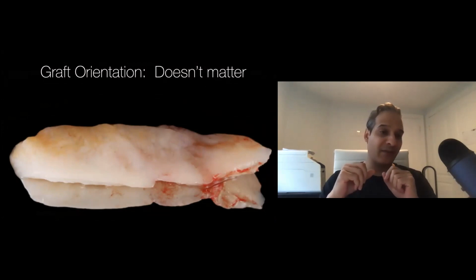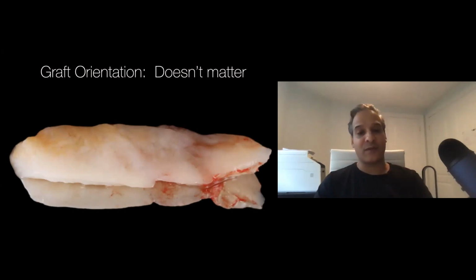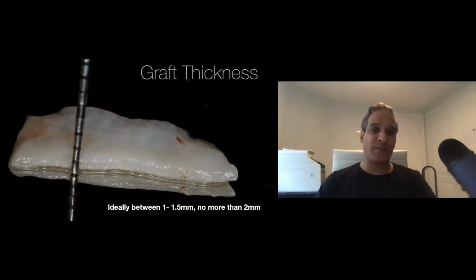Once you harvest it, you can put the periosteum side against the root surface, or you can flip it and put the tissue side on it. It doesn't really matter. Both really work the same way. Graft thickness, again, I mentioned this before. Ideally, you want it between 1 to 1.5 millimeters. You don't want it more than 2.